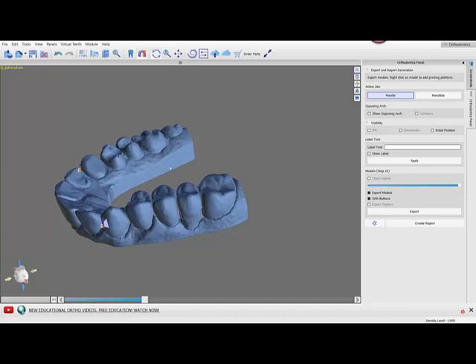First of all, to add the platform you need to be in the orthodontics panel, but at the very last phase where it's export and report generation.